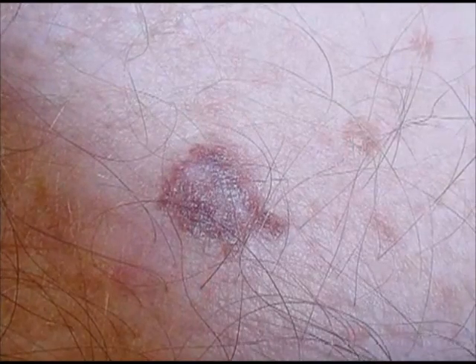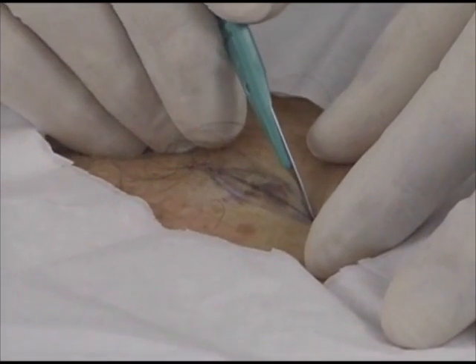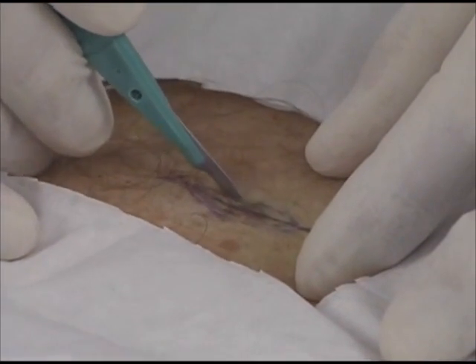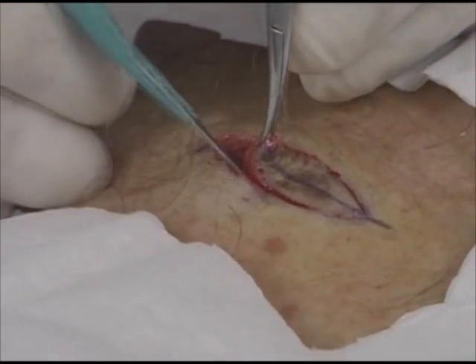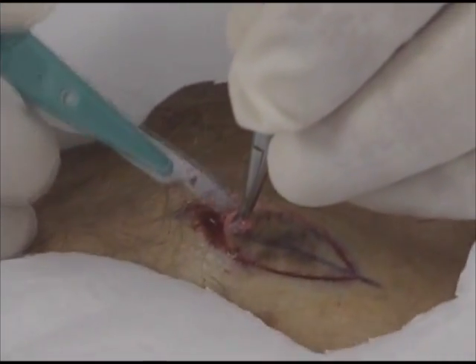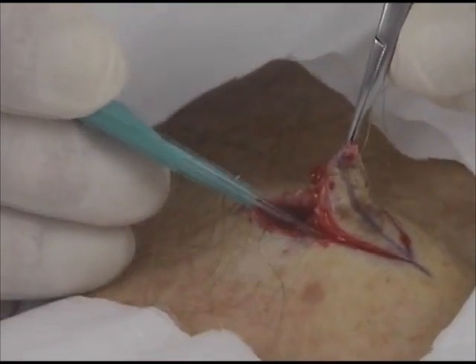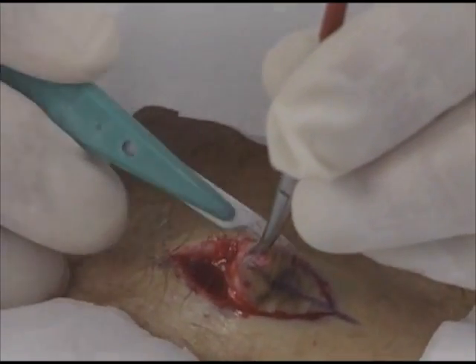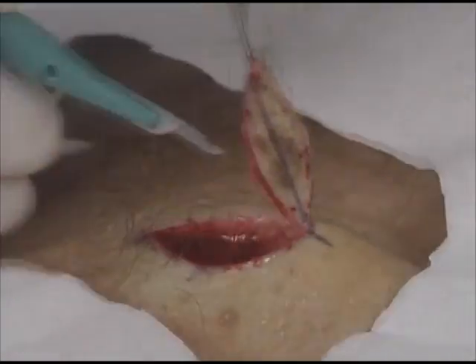This pigmented lesion is suspicious for melanoma. A number 15 blade on a scalpel handle is used to cut the fusiform excision. The excision is performed in two passes. The biopsy specimen is then removed from one edge to the other using a hemostat to grasp the corner of the ellipse. The lesion is cut off in the subcutaneous fat. The traditional instrument for excisions and shave biopsies is the scalpel — it is inexpensive, the blades are disposable, and the cuts are clean. The scalpel causes no heat-induced tissue damage that could obscure the pathology specimen. Using electrosurgery in place of the scalpel has the advantage of facilitating hemostasis while cutting. However, the lateral heat produced by electrosurgical instruments can cause tissue damage that might cause slow healing and artifact on the edges of the biopsy specimen.